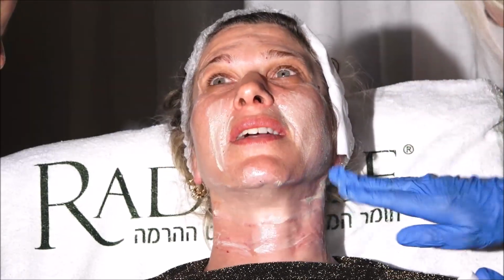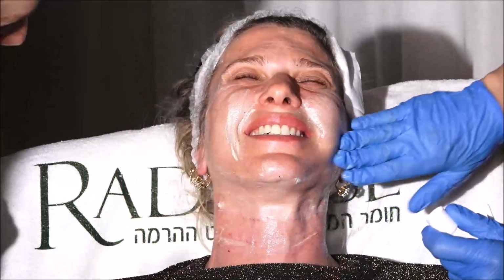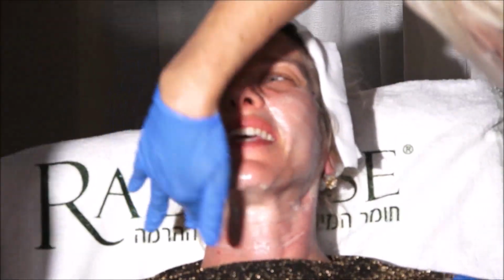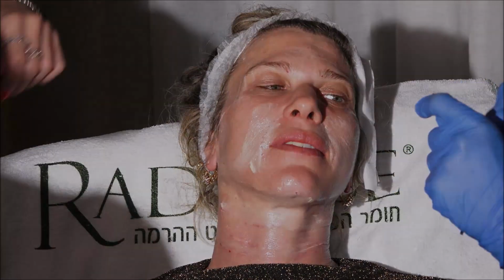I like to use the 4, but normally, because I don't have good syringes for the 4 in Spain, I use the 6. That comes, the BD6, the ultrafine, this is what I use normally.